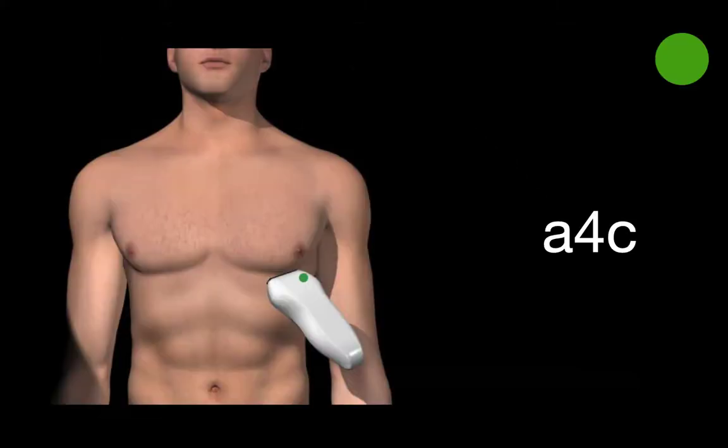The next view is the apical 4-chamber view, which is my favorite view. This is obtained by placing the probe in the inframammary fold in men and women, or just beneath the nipple and slightly lateral. Your indicator will now be pointing towards the patient's left elbow.